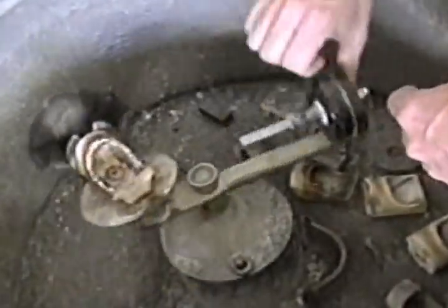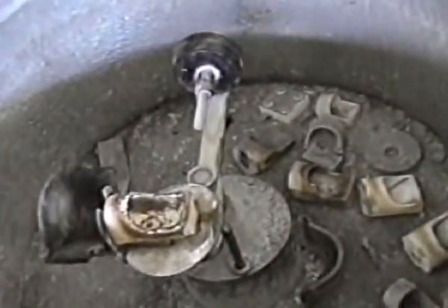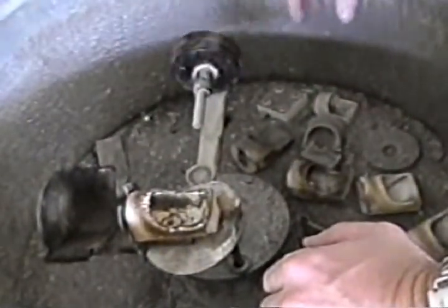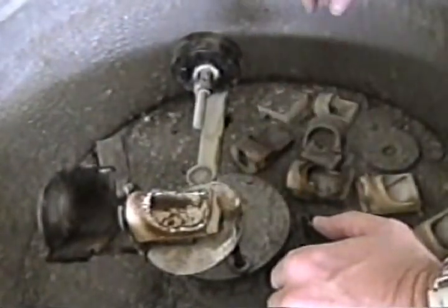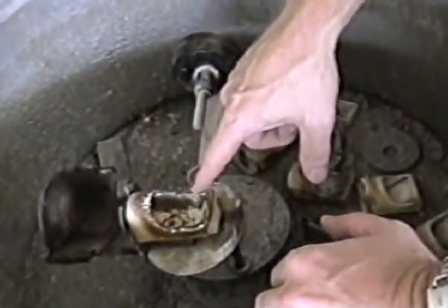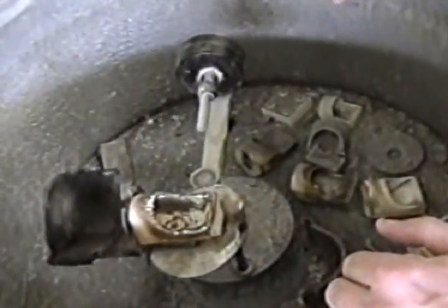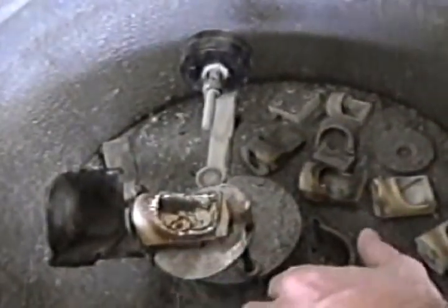And I'm going to wind this 3 times. I have a locking pin here that will hold it. Make sure that my cradle is the right size for my ring. That's okay. Have my weight set here. This machine is based on a strong spring in the center of it here. And you wind it up and you melt your gold in your crucible here. Place your ring in the cradle, slide your crucible up, pull this back and release the pin here and just let it go. And the gold will shoot into the ring, filling the void inside the investment.